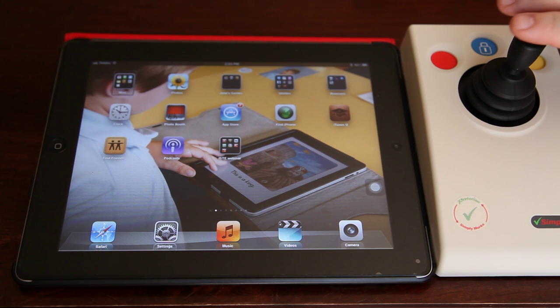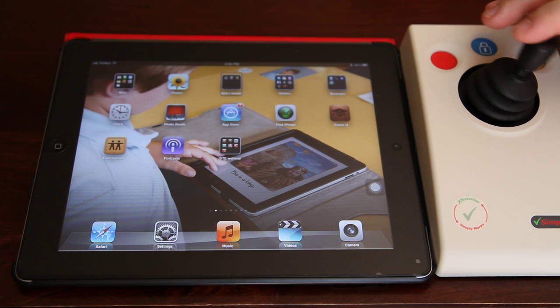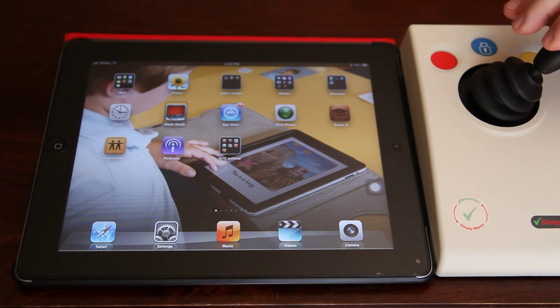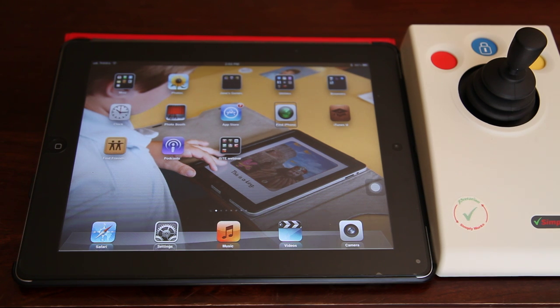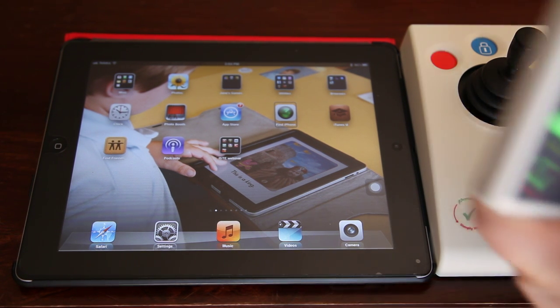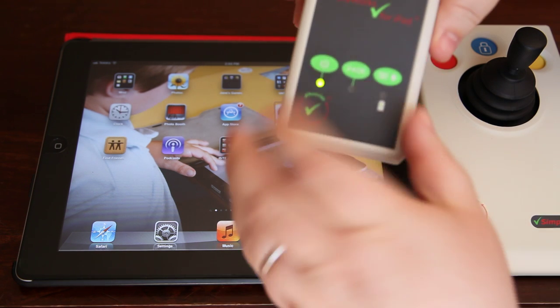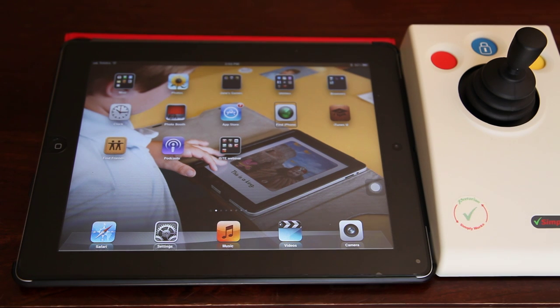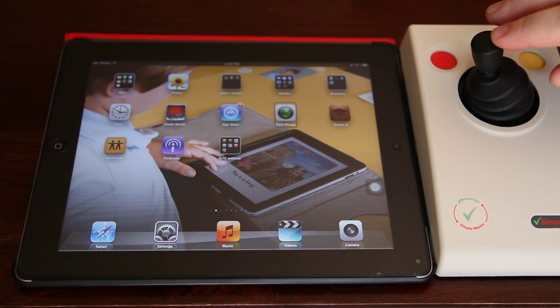I've turned VoiceOver on now and the SimpliWorks joystick should just work. All I need to do is move the joystick control and the VoiceOver highlight moves between options on the home screen. When I turn VoiceOver on, by default the voice is actually on, but I can press this button on the SimpliWorks for iPad and turn the speech off. So now I have a visual cue only as to where the joystick is.